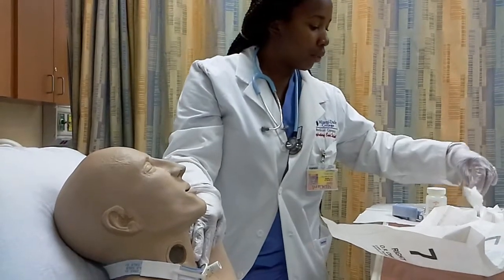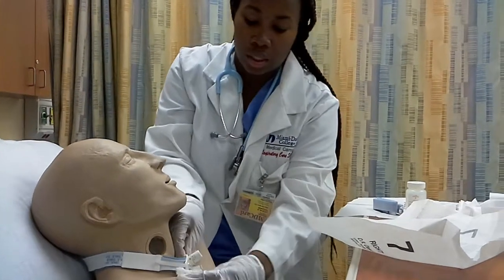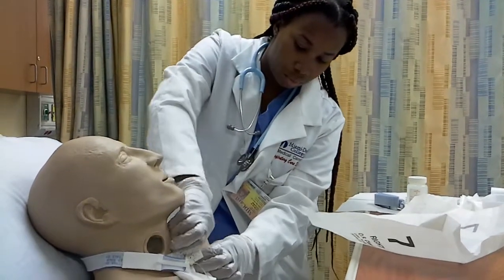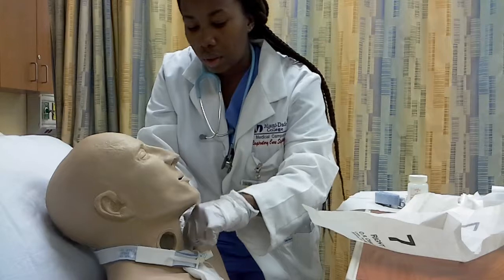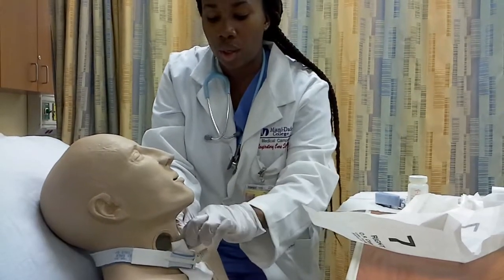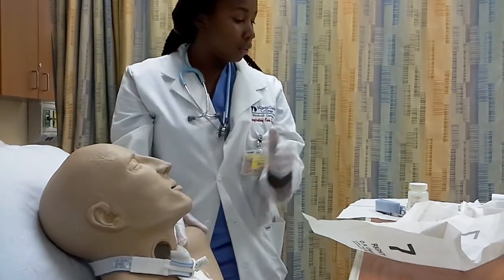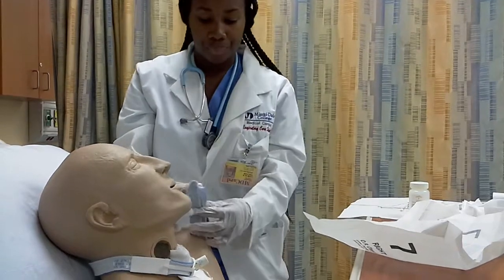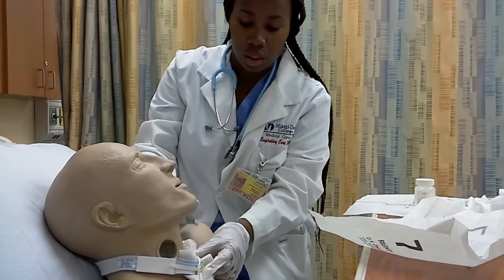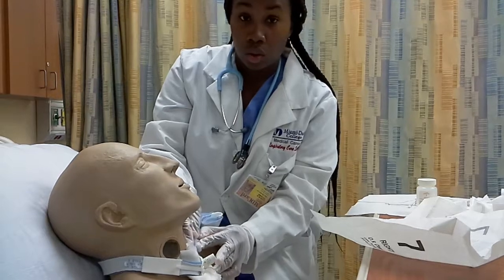Okay, then I'm going to get a pre-cut sterile gauze, and I'm going to put it under his area. This will be his clean dressing. So now that I have put this on here, I'm going to now remove his trach collar because he needs a clean trach collar. So I have this one ready. I'm going to take this one off. The whole time you always want to maintain a hold of the trach tube because you don't want to lose that airway.